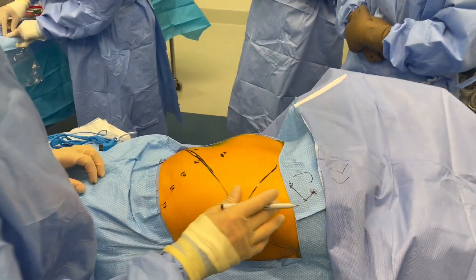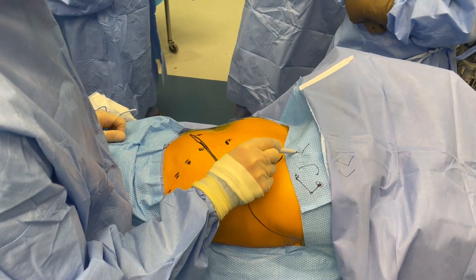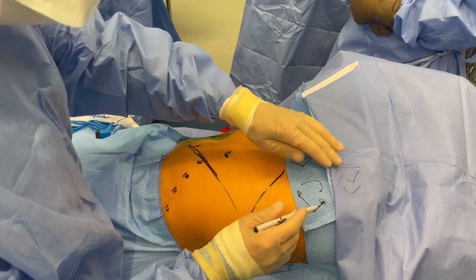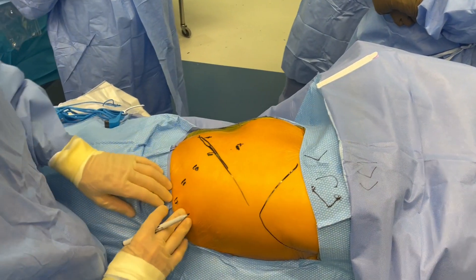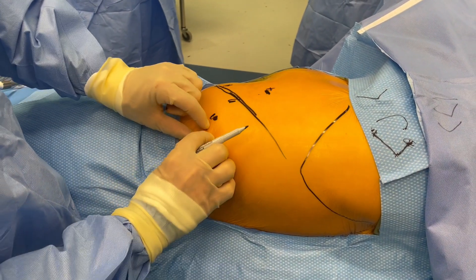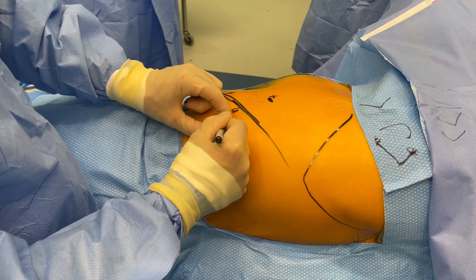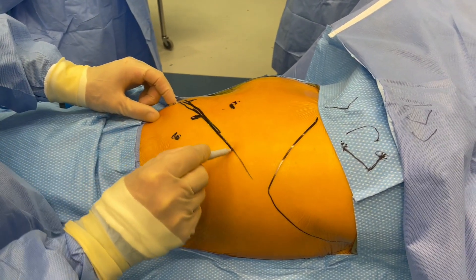I was just drawing a little diagram here. A lot of people will talk about making a V incision like this, and what we've done is made our softer V, kind of like this. So you find your patient, you count your ribs — ribs 12, 11, there's the 10th rib, and here's the 9th rib. You mark out the entire 9th rib.